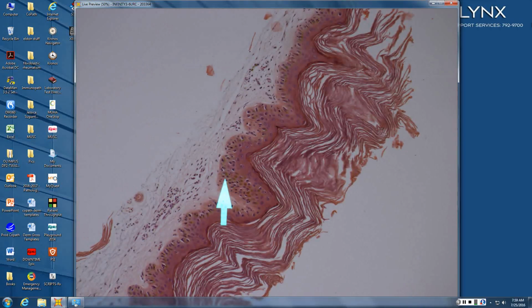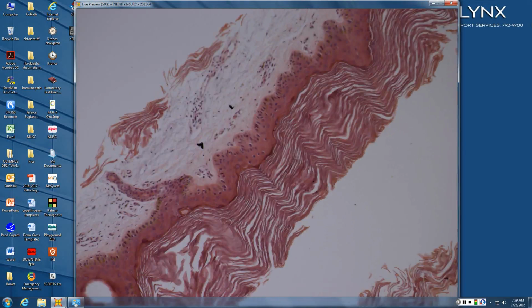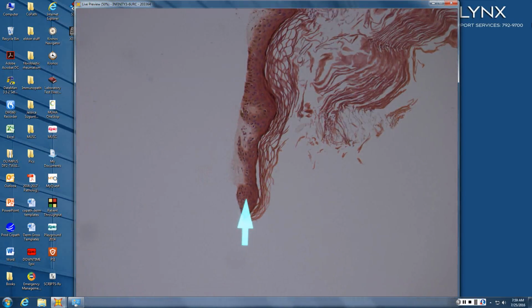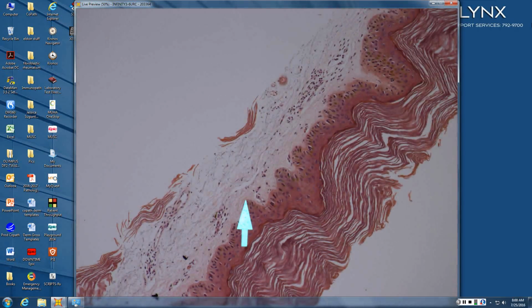A pigmented hyperkeratotic seb, and are the cells larger or smaller than the normal keratinocyte? Smaller. In this case, I'd say larger. So correct, larger, with this being normal. That's normal. Yeah, larger. So this one, not surprisingly, is pigmented and has some lentigo-like features, and is that kind of merge of large cell acanthoma, pigmented seb, lentigo.